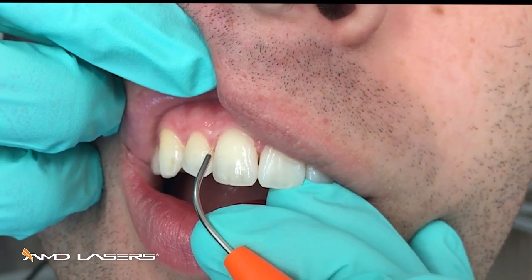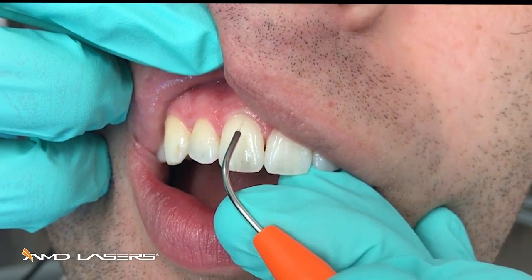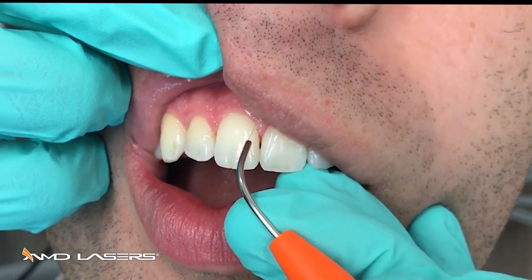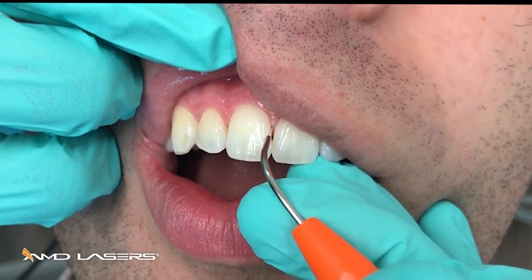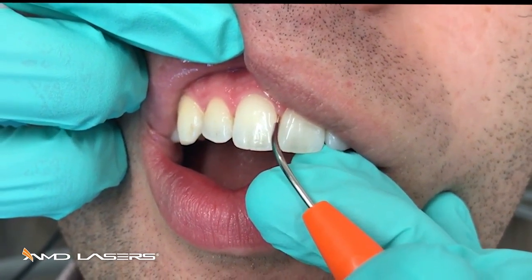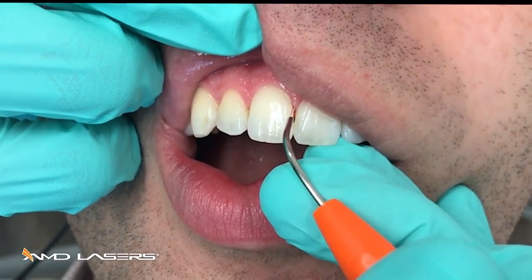Very slow and controlled movements under the gingival margin, at least a millimeter. When you get in approximately, make sure you angle towards the depth of the pocket. Very slow, gentle, sweeping strokes.